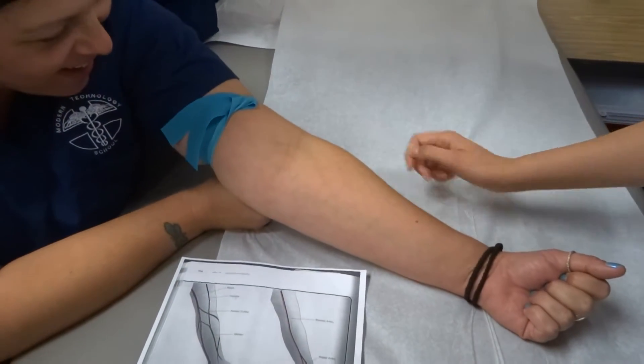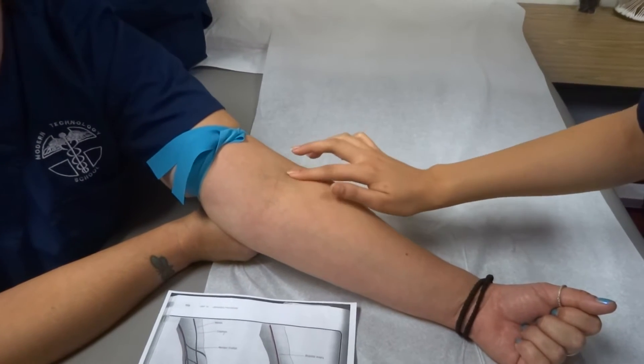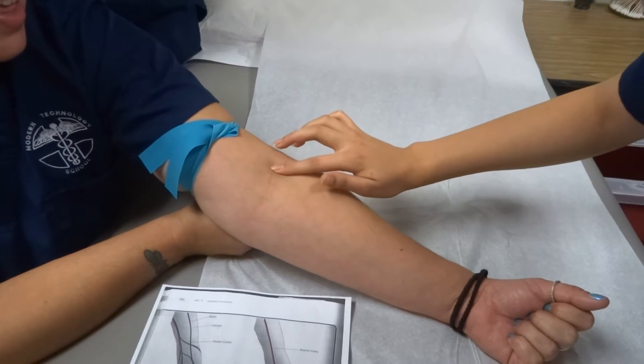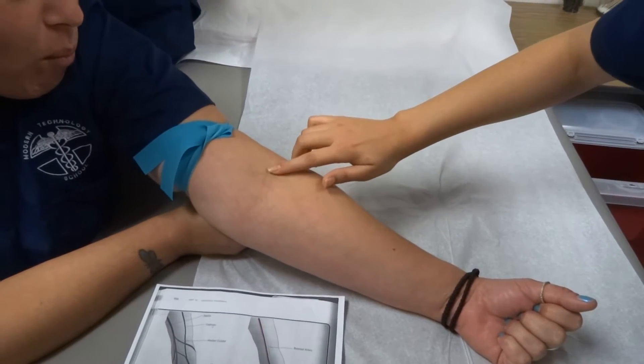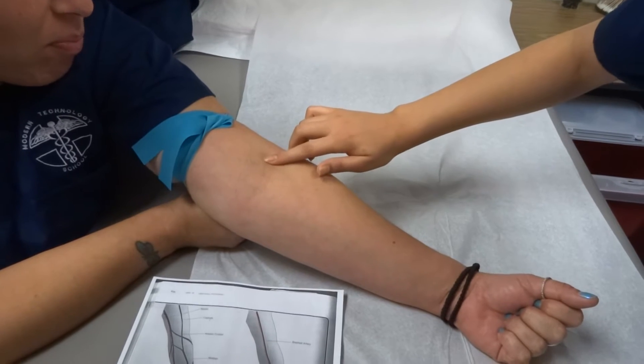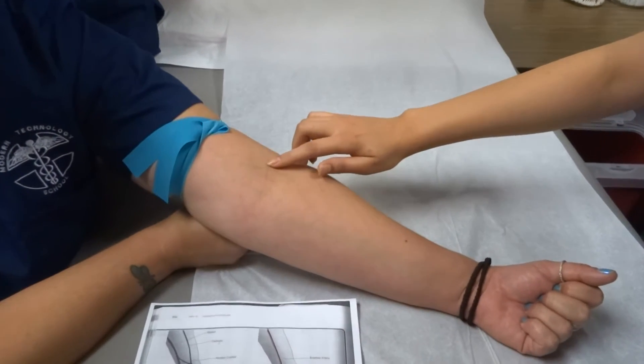Okay, see what you can find. I don't have none — they're hiding, they're deep. How about that one? No, that's just a little spider vein. That would just collapse right away. It wouldn't even get a sense. Remember it was in there? Is it this one? It was so superficial though, right?